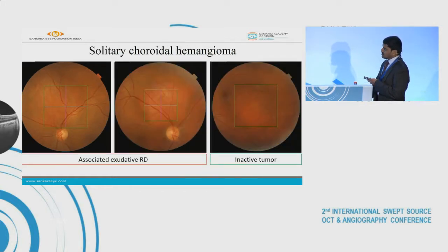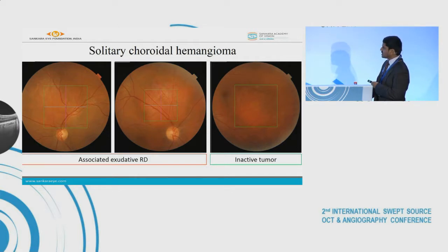We can see three cases of solitary choroidal hemangioma. The two on the left were associated with an exudative retinal detachment, but this particular tumor was inactive.